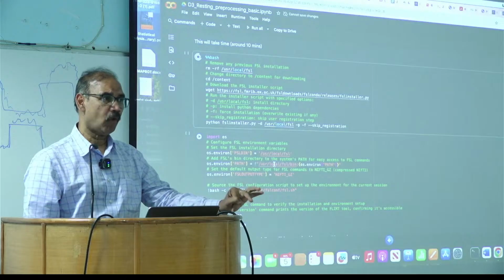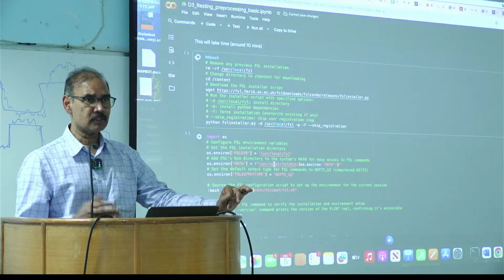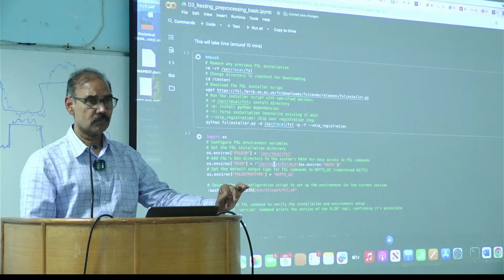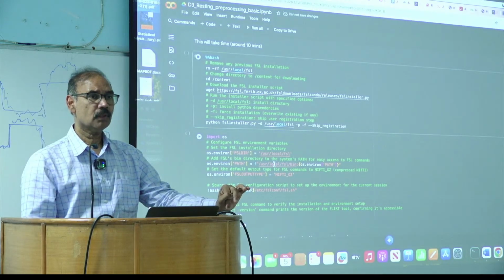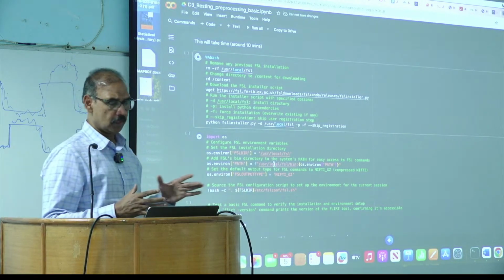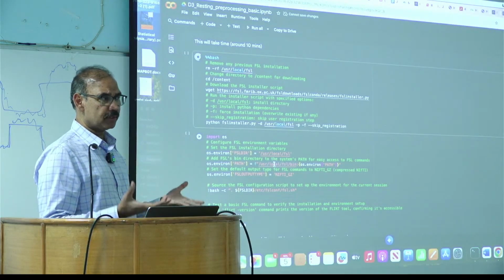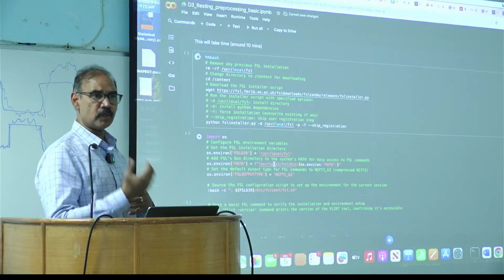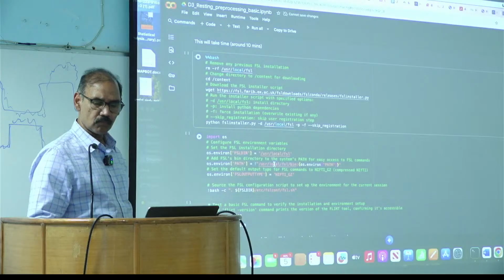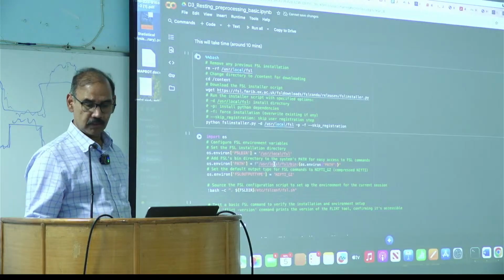Can anyone tell why we should do motion correction first and then spatial smoothing? Right, so you would make the images which are not registered smoother. So trying to register is going to become more difficult. All right. Any other question?